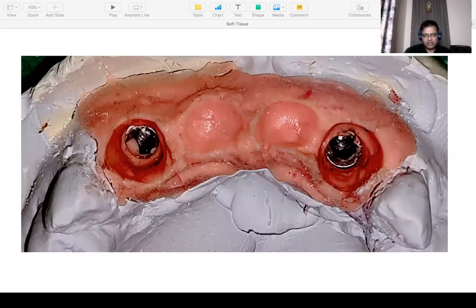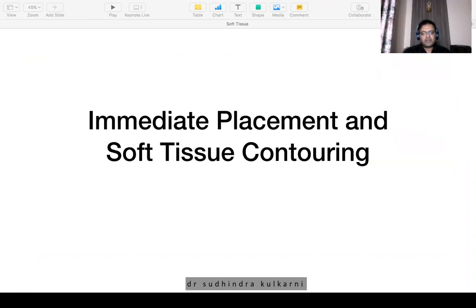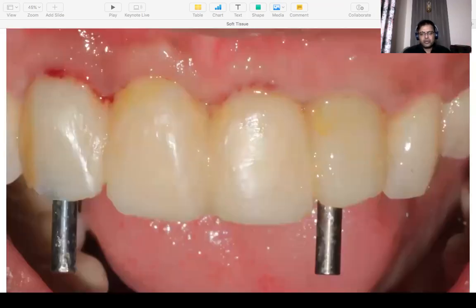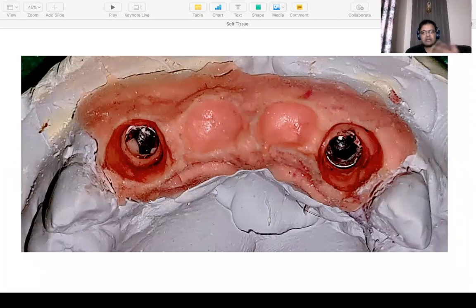by the time we had the master model ready, I have a beautiful emergence on the 2 implant sides, and I have 2 beautifully trapezoidal contoured central incisor sites where my lab will give me the same emergence. And you can also see we have a beautiful papilla now between the 2 implants and also between the pontic sites and the implant sites. So the lab will now give me a beautifully made restoration. This case has not been restored. So I'm just showing how you can work on the hard and soft tissue using gingival formers at the time of implant placement to get additional soft tissue height, and then customizing the temporaries and contouring them out.